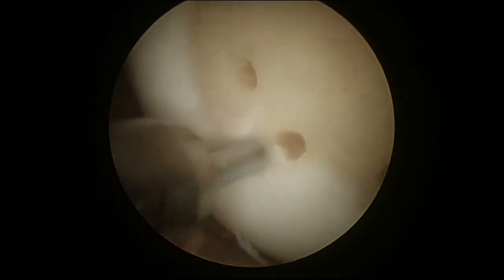One nice thing about use of the PowerPick is that it attaches to a normal shaver. With the traditional microfracture awl you actually use a mallet and hammer in a pick, which can sometimes fracture the location site.